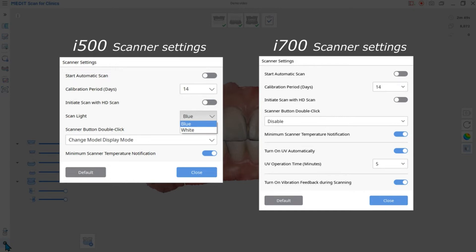Let's check the common settings between the I700 and the I500. Start Automatic Scan enables you to automatically start the scan without pressing the button upon entering the next stage.